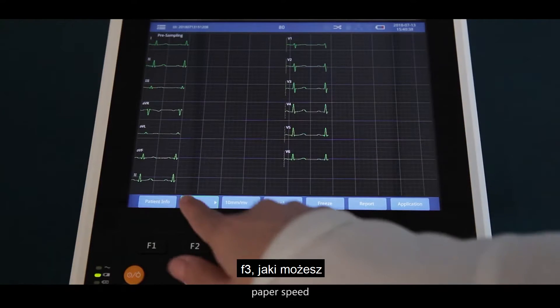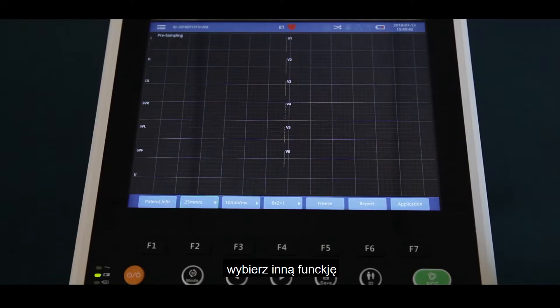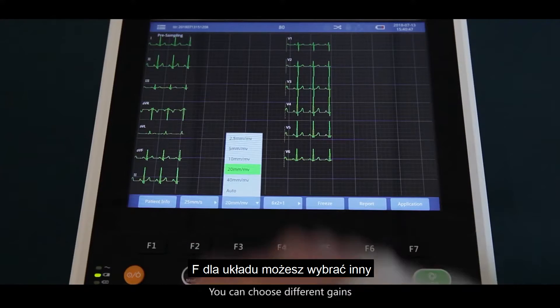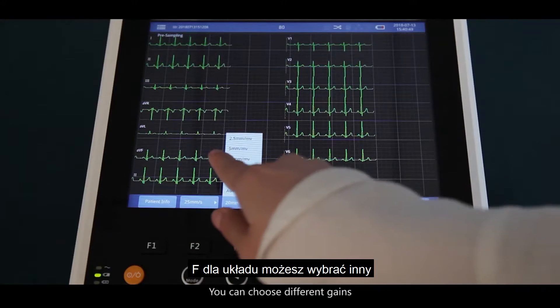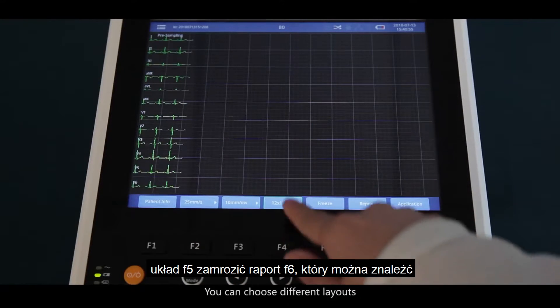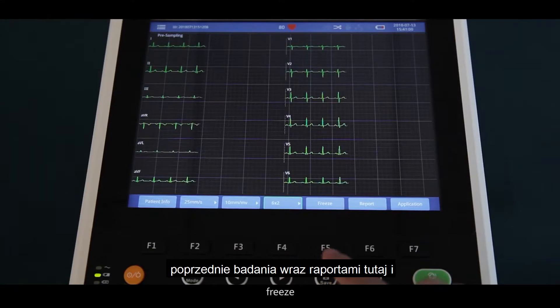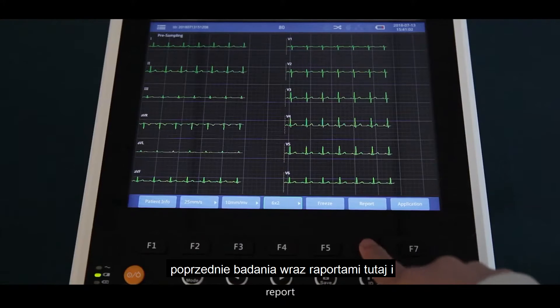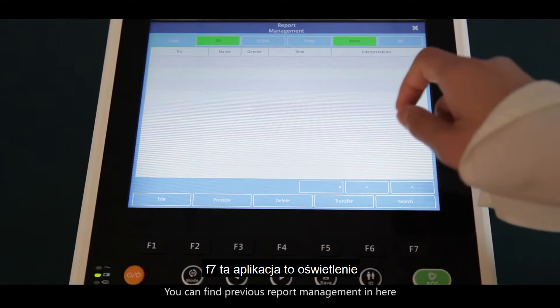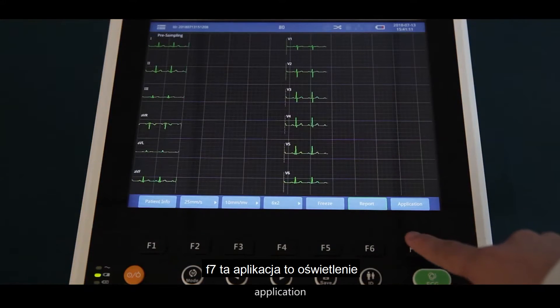F2 is paper speed — you can choose different paper speed. F3 is gain — you can choose different gain. F4 is layout — you can choose different layout. F5 is freeze. F6 is report — you can find previous report management here. F7 is application.